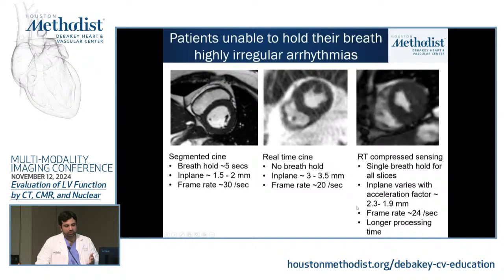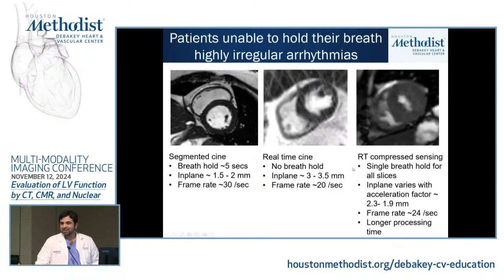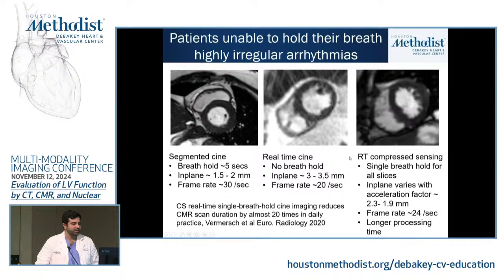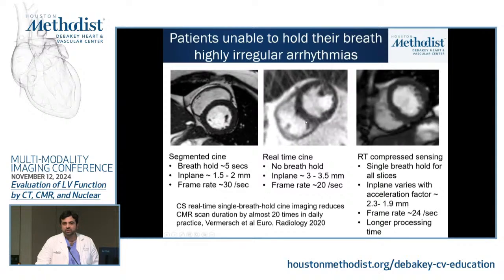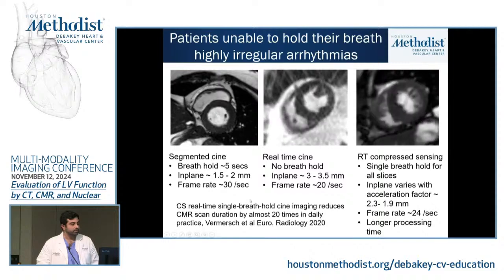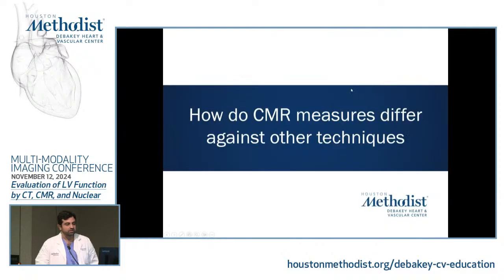It takes longer to process, but nowadays with improvement of all the processing techniques and NVIDIA, like I said earlier, those processing powers have improved dramatically. So nowadays, really all you need for many scenarios is for the patient to be able to lay flat in the scanner and tolerate being in the scanner. And this really can speed up the acquisition, because the acquisition itself is much faster than this. It's just the processing that takes longer.